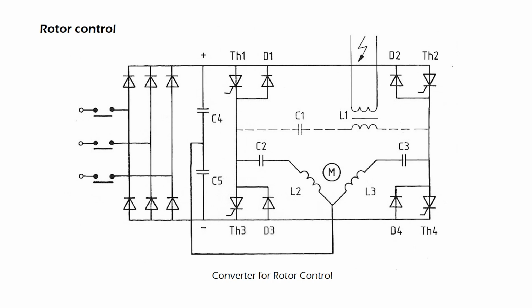During the standby and the preparation stage for high-speed acceleration of the rotor, the converter of the generator is connected as a rotor control. The thyristors TH1 through TH4 are caused to fire by initiation of preparation. Now two half bridges are working independently of each other, with a phase control making sure that the inductance L2 and L3 provide the stator with a rotary field.